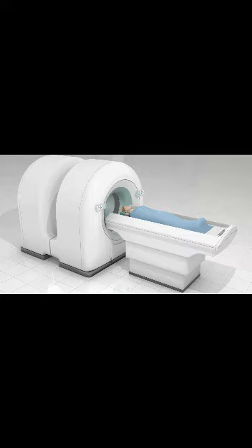PET-CT is useful in detecting and differentiating inflammation and malignancy in patients with systemic autoimmune disease. Can a PET scan tell if a lymph node is cancerous? A PET scan, which uses a small amount of radioactive material, can help show if an enlarged lymph node is cancerous and detect cancer cells throughout the body that may not be seen on a CT scan.